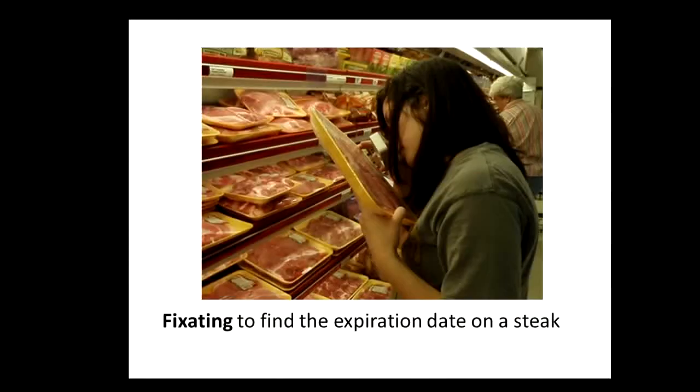This student is standing at the meat section in the grocery store, fixating to find the expiration date on a packaged steak. Note how she uses the fingers holding her magnifier to stabilize her hand on the actual meat package, which helps her maintain the correct focal distance with her handheld magnifier.